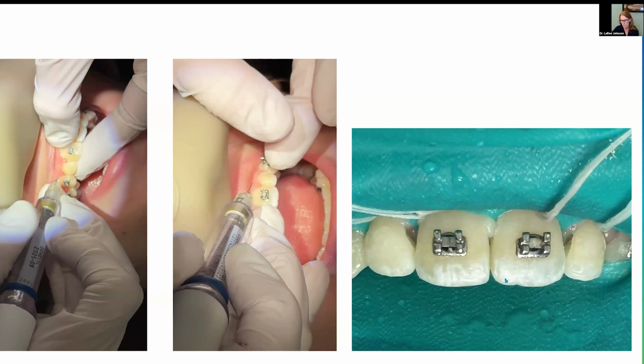I'm not going to get into this because I want to get into a day in the life, which is a request by someone to do this. But I just want to let everyone know that when you are seeing the permanent dentition and you're doing something that's going to take you a while, let's say instead of these mesial defects, these were peg lateral buildups, and we were going to be there working for a while. You might go ahead and anesthetize both, depending on how efficient you are. But if it takes you a while to get it just right, you take your Boley gauge and you're measuring and doing all this stuff to get this perfect peg lateral buildup, just remember when you get to the other side, you might consider just adding a little bit. And that's an example of needing to do some more.